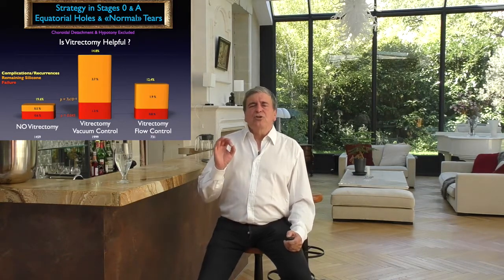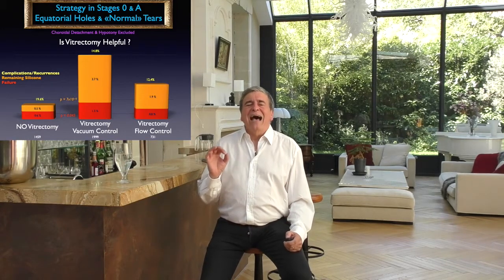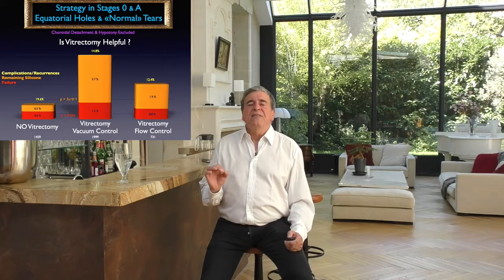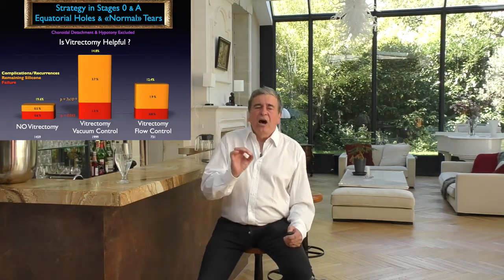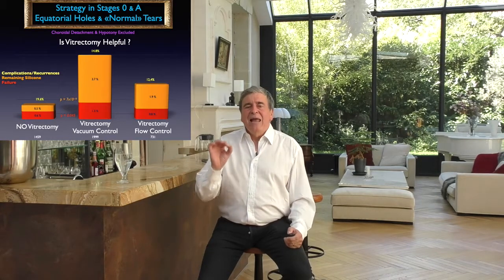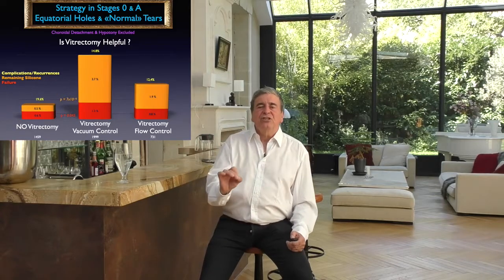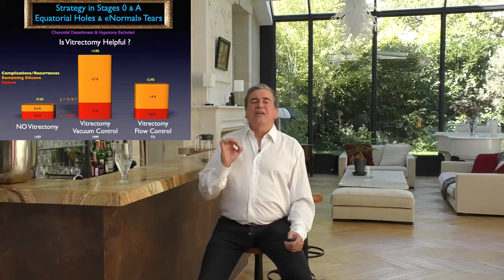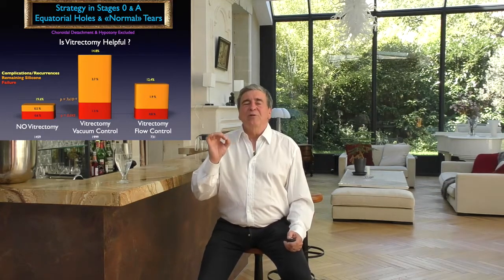This clearly demonstrates that the aspiration flow control has an influence on the anatomical results. Depending on the type of fluid control you have, you will have to opt for cutting and aspiration parameters that will ultimately not lead to the same result.